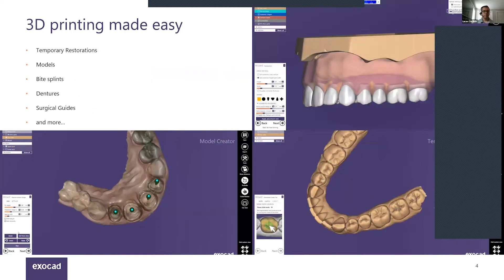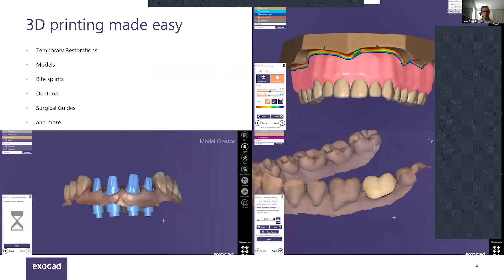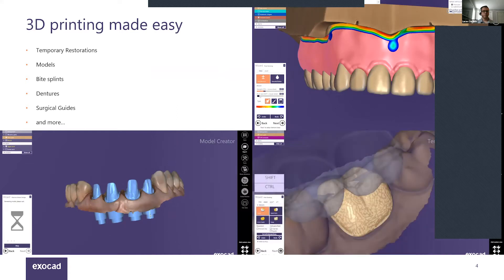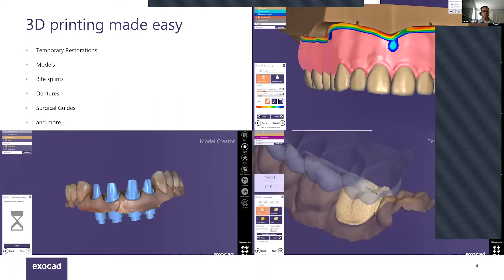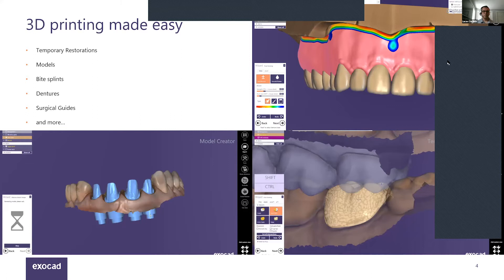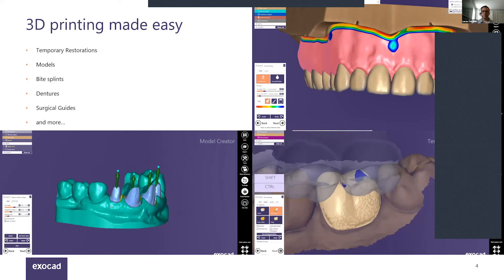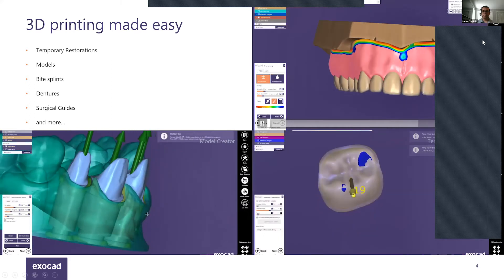Here you can see some video playback of our design scenes — model creator with removable dies, the ability to add gingiva material for segmented printing, adaptation of a temporary crown for patients with existing dentition being removed, and digital dentures, which is a very hot topic right now. Highly recommend anyone with a 3D printer to start exploring that indication.